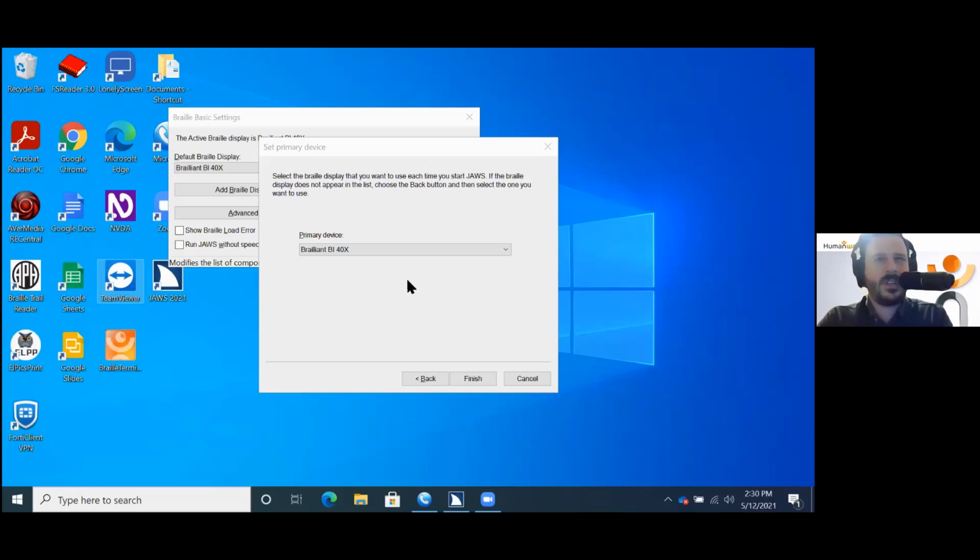Again, you can do this from the keyboard. There's no reason that I can't just use my QWERTY keyboard. But knowing that this is an option to fully drive the JAWS screen reader from the Braille display is very useful. I'm going to turn keyboard help off. Again, it is a toggle, so I'm just going to press command keys 1, 2, and 5 and turn this off. Off.